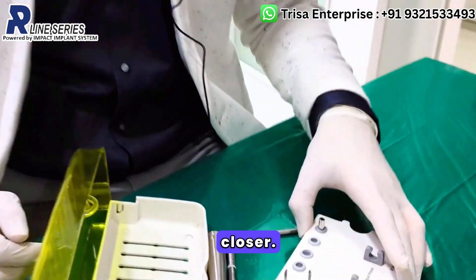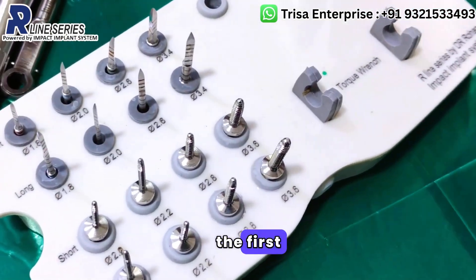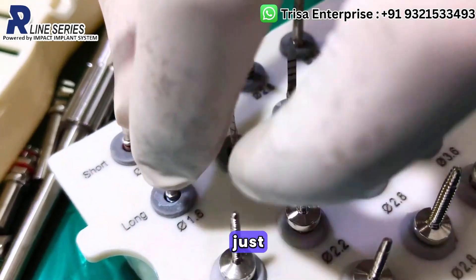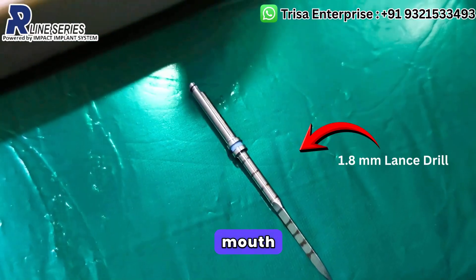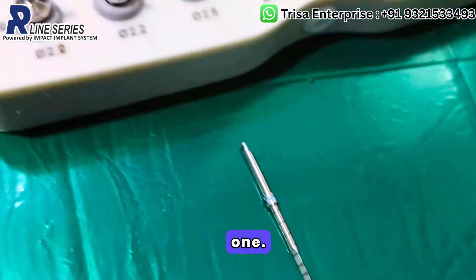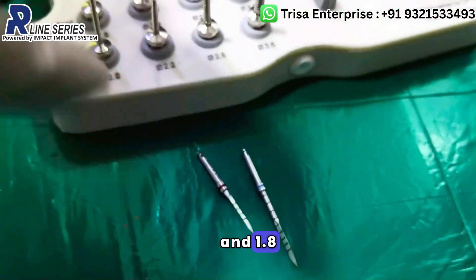For all practical purposes, your primary drill — the first drill you will pick up — is this long drill 1.8mm. Of course, if the patient's mouth opening is less, or for whatever reasons you want a shorter drill of the same diameter, then you can pick the short one. So you have a 1.8 long and a 1.8 short.